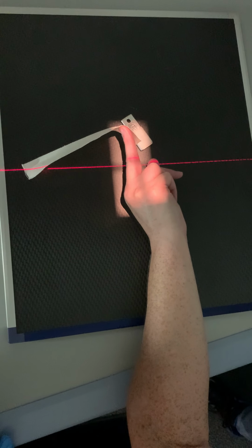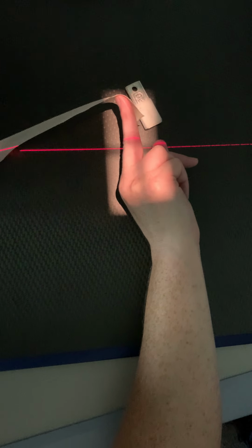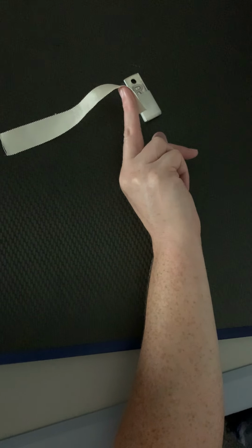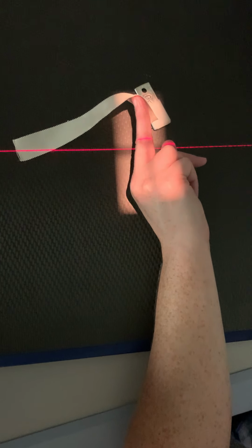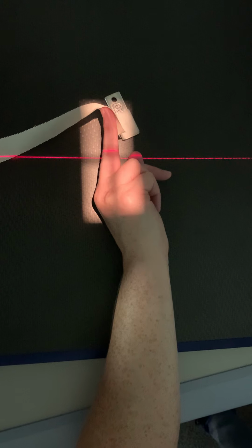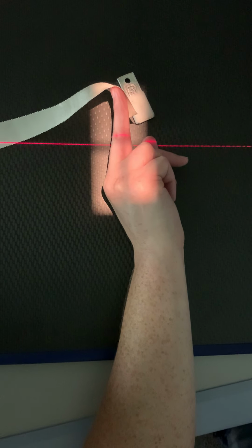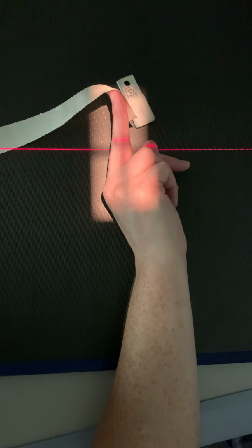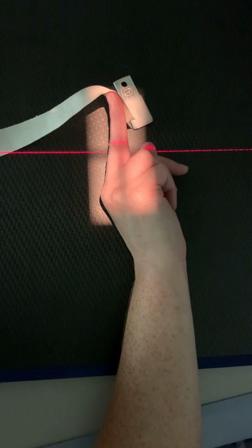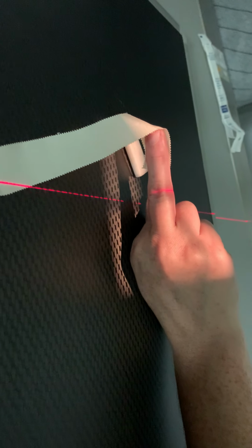Got to get at least 1 inch past the tip, and make sure that my marker is not in the way. There we go. So that's her lateral. What digit is that? Third digit. Notice that the finger is straight. It's not tipped down. Same distance all the way to the end there.